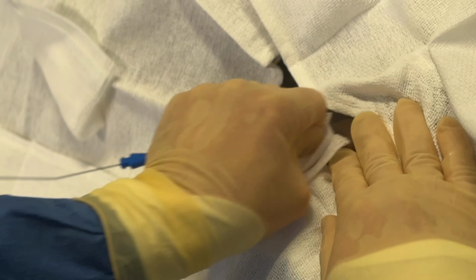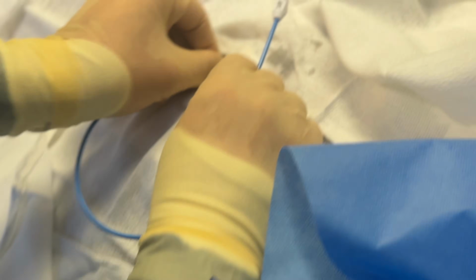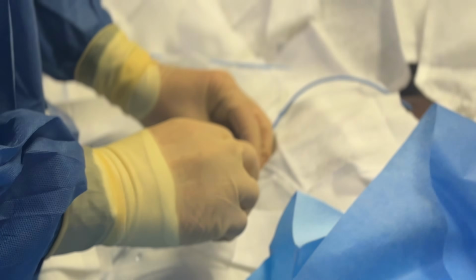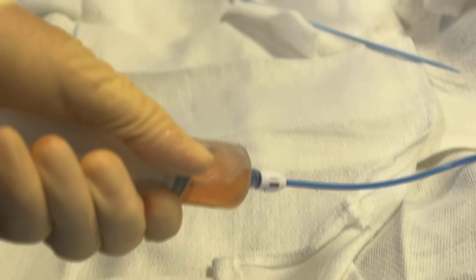You will then dilate, you will then put your drain in. It's very important never to dilate in the ventricle. Serious.